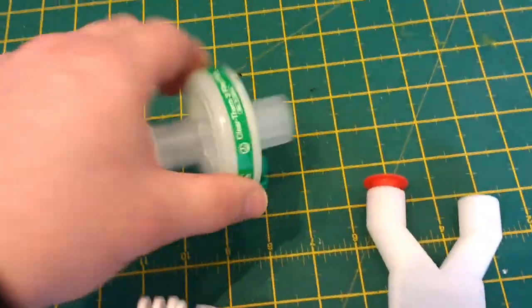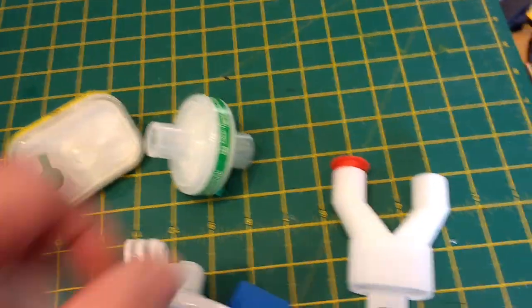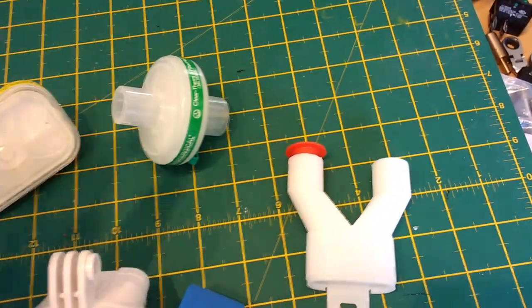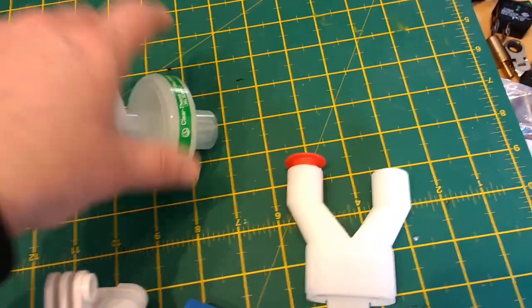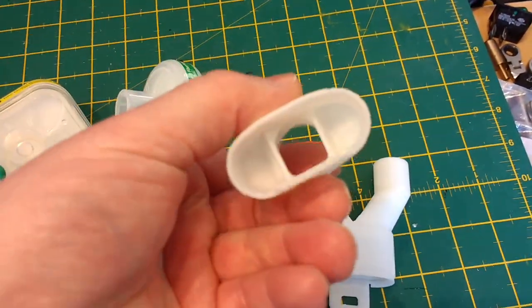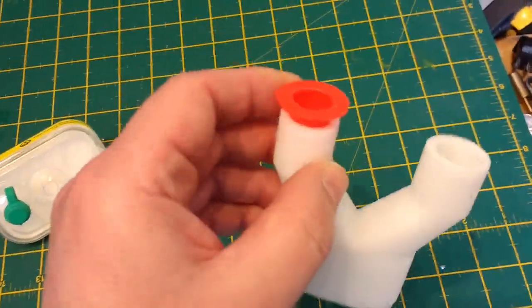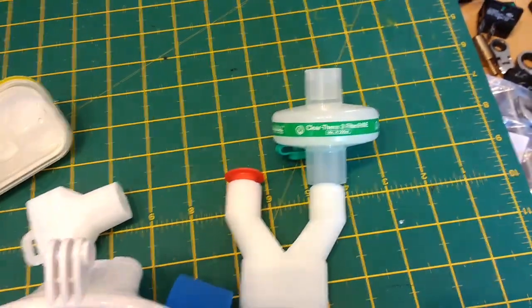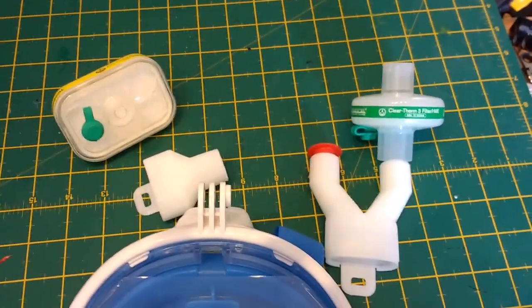The reason double splitter ones exist is because the work of breathing through one of these is okay but not pleasant, and people have suggested online that having two is better. For the test, because I'm just going to use one, I'll connect the filter, block off one of the ports on the Y-connector, and then we can do a reasonable back-to-back test and look at my own end-tidal CO2.